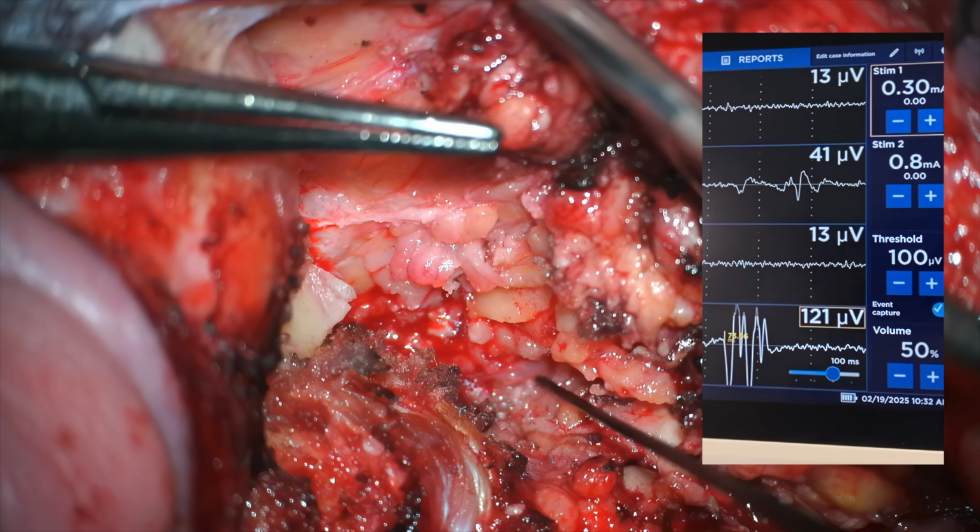Now, okay. There. See? Good. There are sensory branches. That's an artery. It's probably an artery. See that thing? Yes, that's probably an artery. Now, that's the thing, go up. Up. Yeah, that's right. Come through. Poke through.